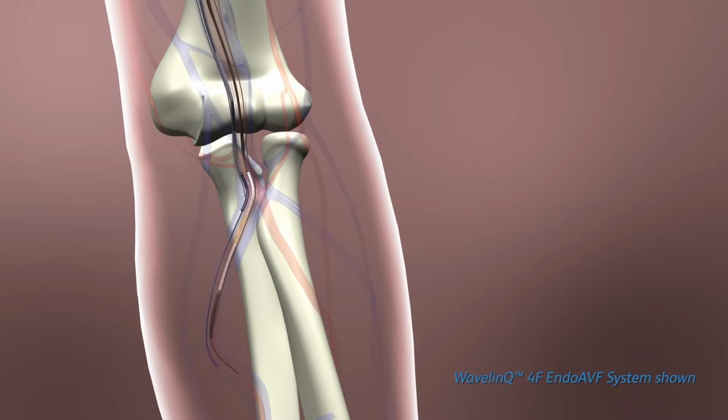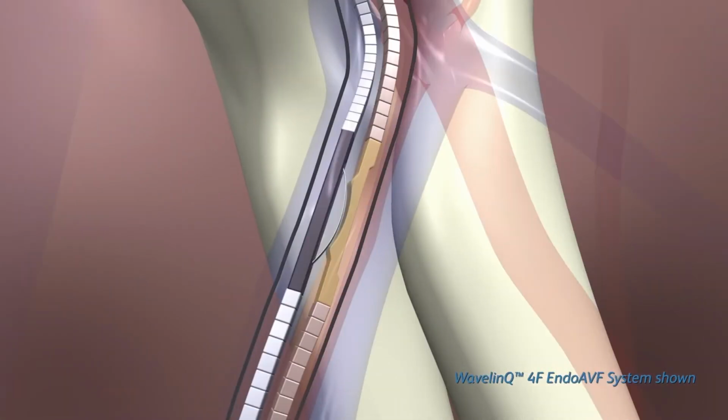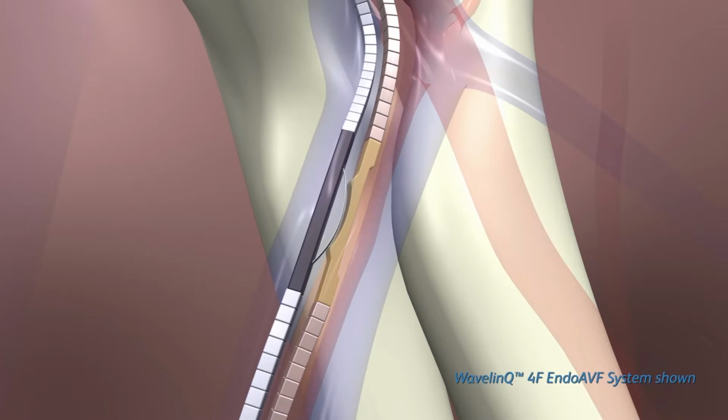When placed in proximity, the magnets in each catheter attract to each other, pulling the vessels together and aligning the RF electrode. The venous catheter, which contains the electrode, delivers a burst of radiofrequency energy to create a connection between the artery and the vein. Then the catheters are removed.